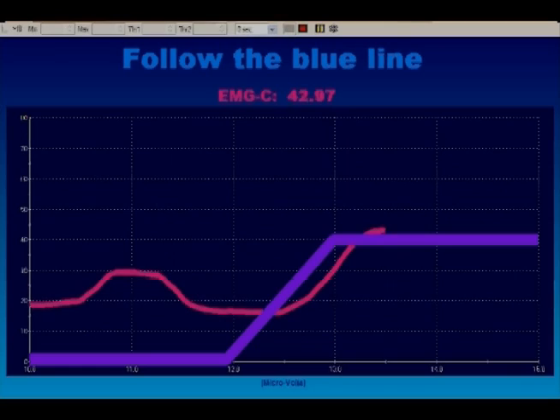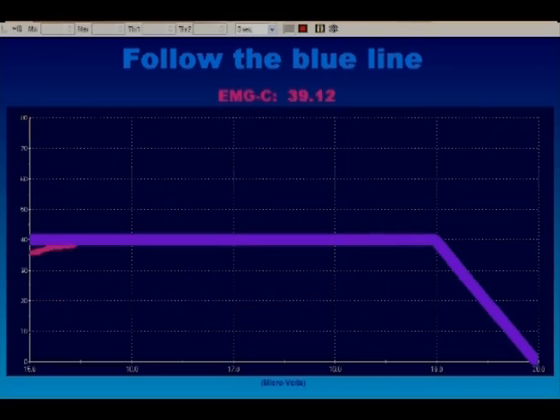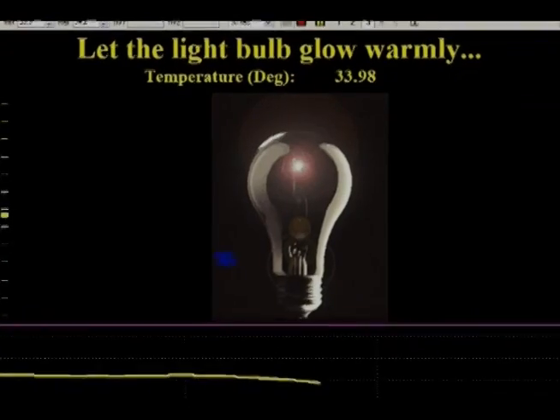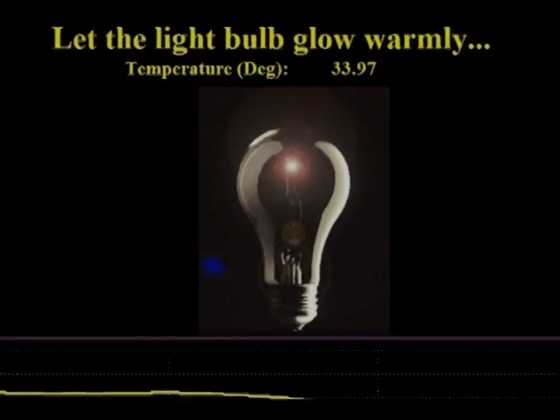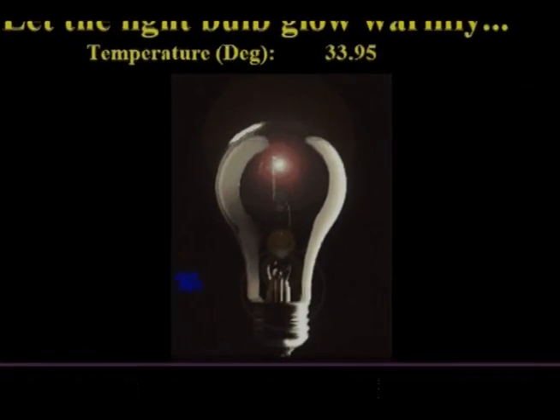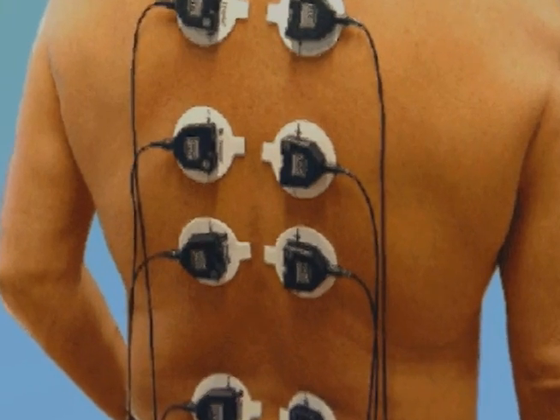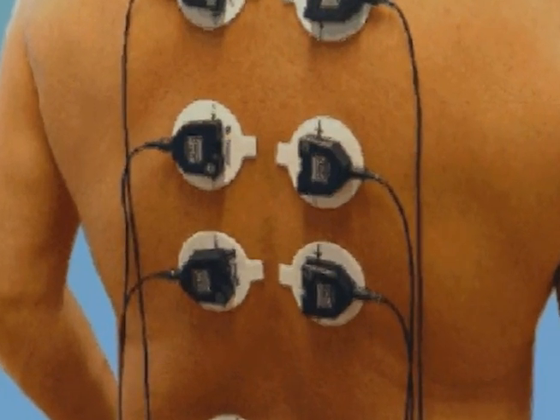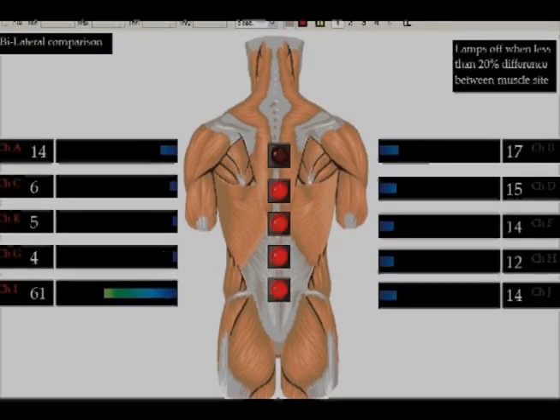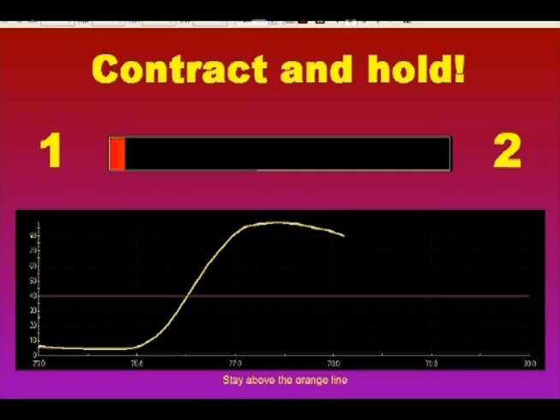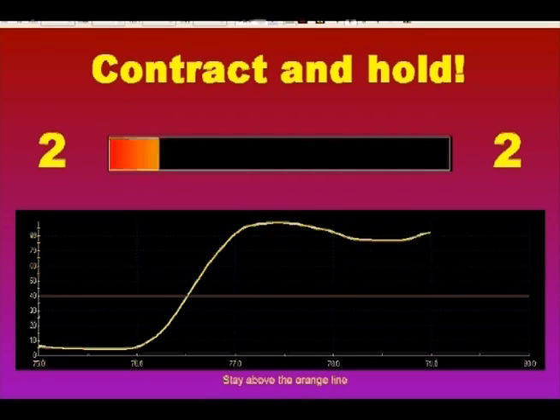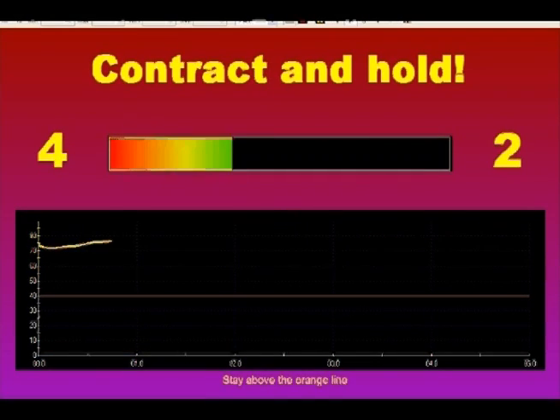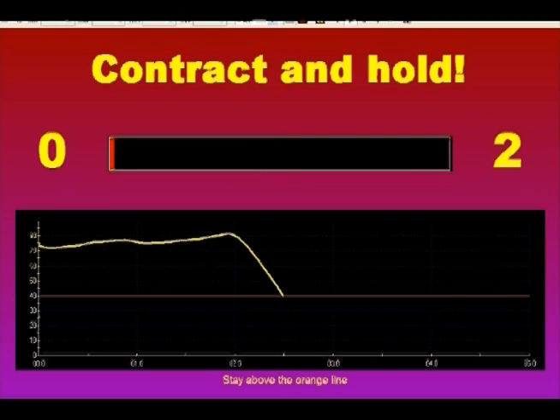Biograph Infinity also allows you to create customized templates to provide specific feedback for incontinence or SEMG rehabilitation. This is a screen to teach relaxation through temperature biofeedback. These screens illustrate how paraspinal SEMG scanning can be used. For incontinence and other applications, we can calculate onset and release times, and other statistics for work, rest, training, and evaluation.